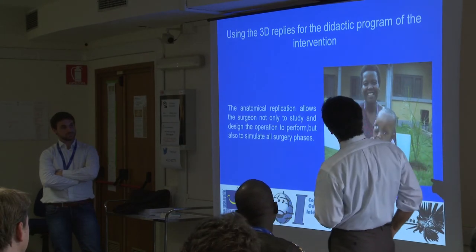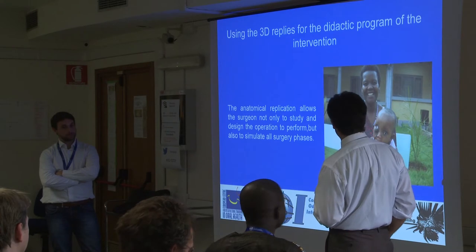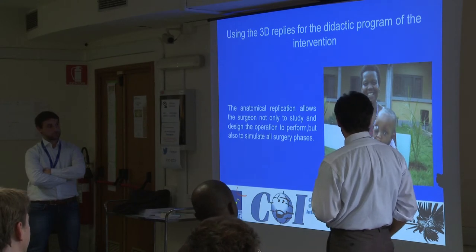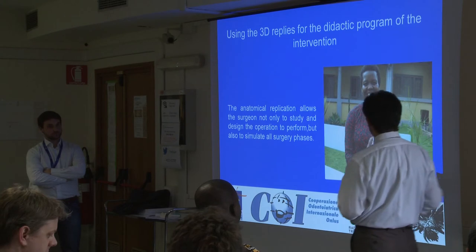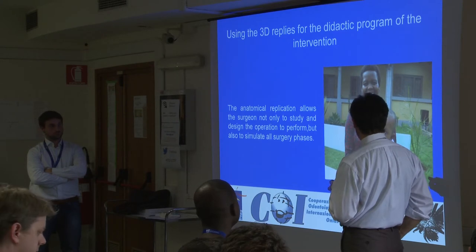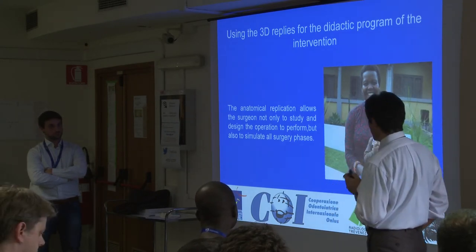Using the 3D replicas for the didactic program of the intervention. So this little boy, 2 and a half years old, is coming from Kitengela, near Nairobi, and he has a very big osteolytic process in the upper jaw, in the maxillary bone, and he was operated a few months ago in the Jomo Kenyatta Hospital in Nairobi.